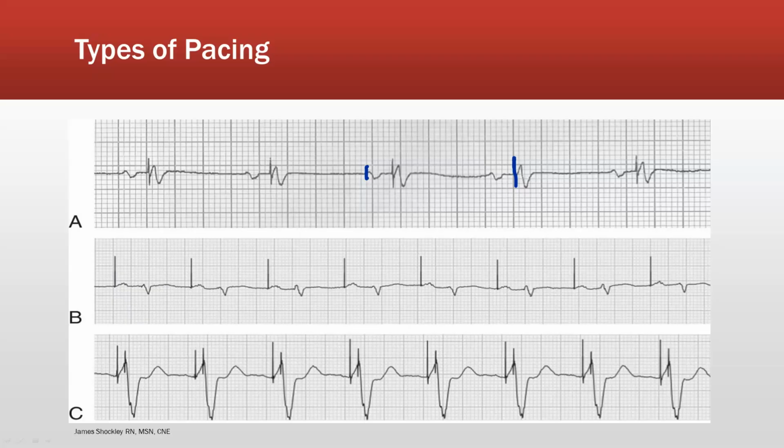And the problem here is that this person's heart rate is only 50. So I don't know what they have their machine set at, but they might want to consider upping it just a little bit, because the ventricles should still be 60 to 100. We want it to be somewhere around its inherent rate.